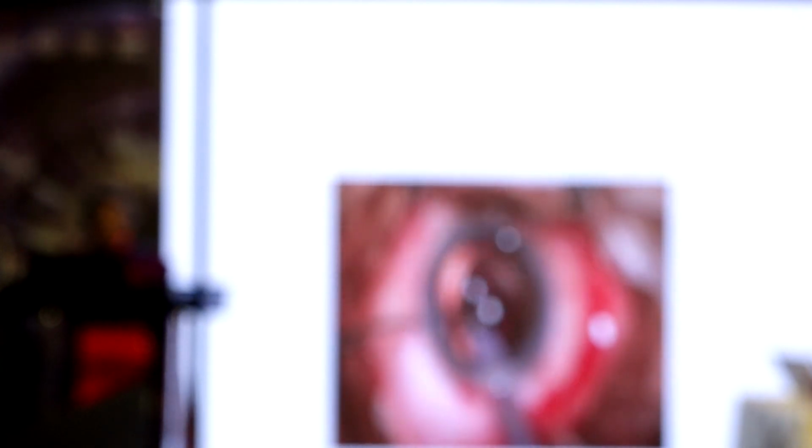So these are situations which we face. We know the ideal situations, but it is not always possible to go with the ideal. So we put in a single piece lens and finally did an IOL scaffold and removed the cortical material as well as the remnant nuclear material.